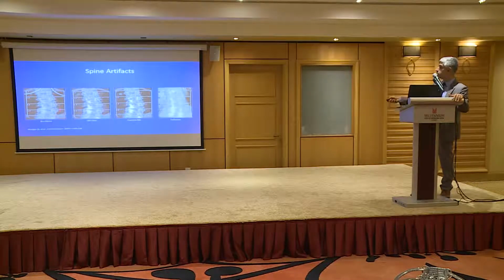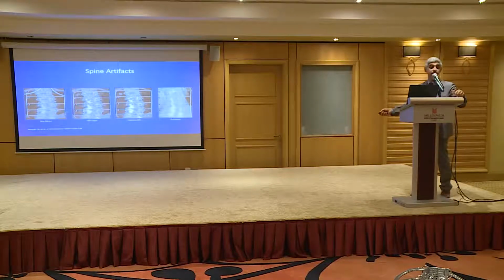Spine artifacts could be bra wires showing, gallbladder clips here, calcium tablets, and large gallstones. A lot of these might not really affect the density, but they are something you will probably see on the image of the DEXA scan and wonder what it is.